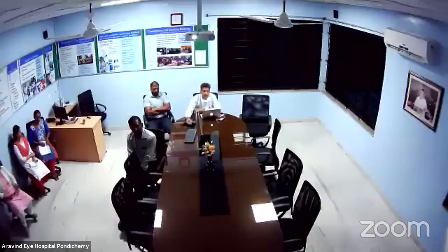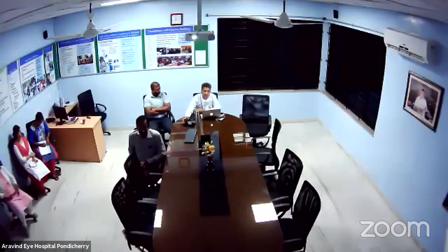Thank you, Shankar. I think the summarization is very important to keep in mind: everything has to be large here because the lens is going to be large. So you have to be kind-hearted and make everything large so that, at the end of the day, you can do a very safe SICS in some of these hard cataracts. But once you start doing some of these hard cataracts, you will notice that the time you take is the same as for a regular cataract.